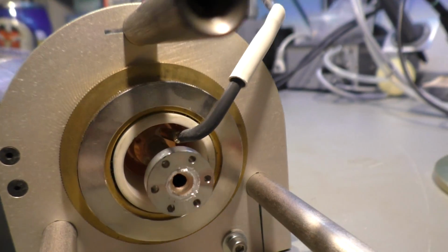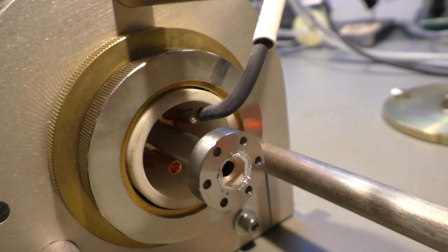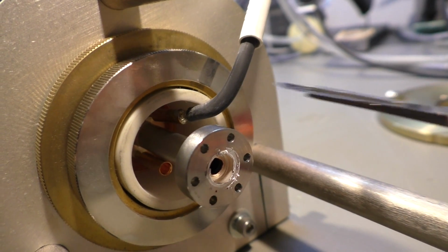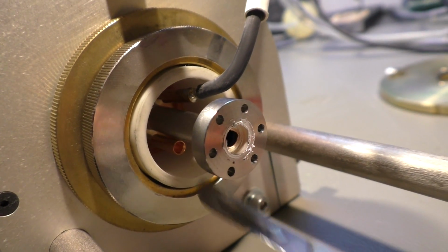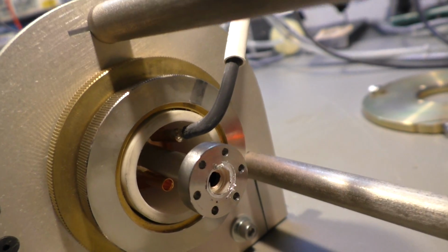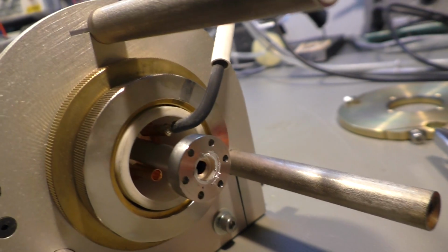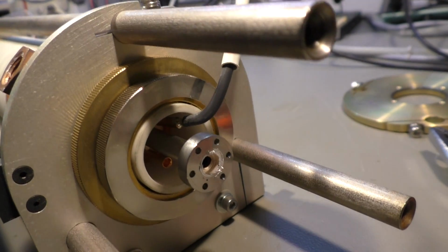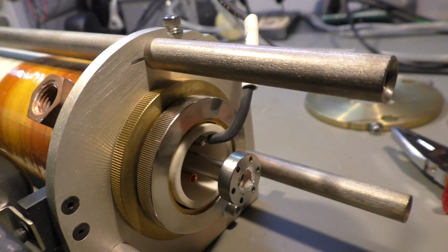Let's have a look inside. There are two copper terminals. One has the input cable attached and the other one is not used. Maybe they are both for the same anode electrode, but possibly the second one has another function.